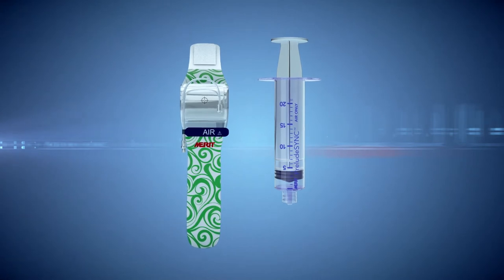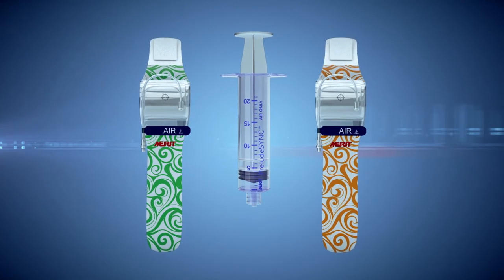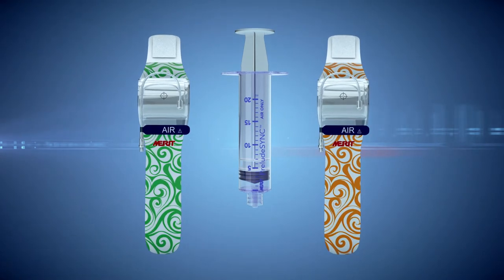It has a comfortable band with a large clear window for site visibility. The Prelude Sink personalizes the patient's recovery experience with an exciting random assortment of designs provided in each box.